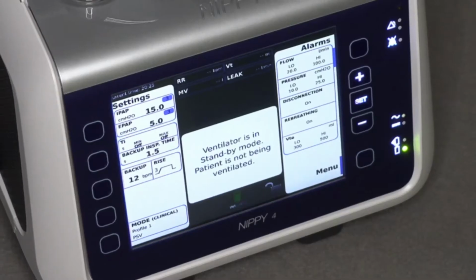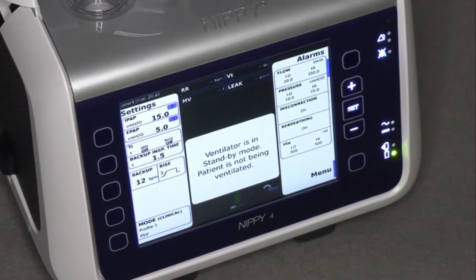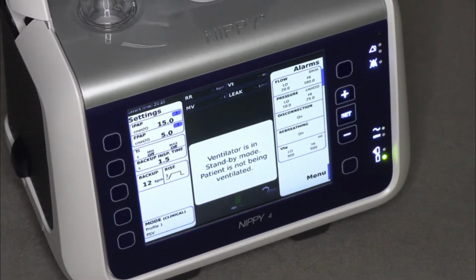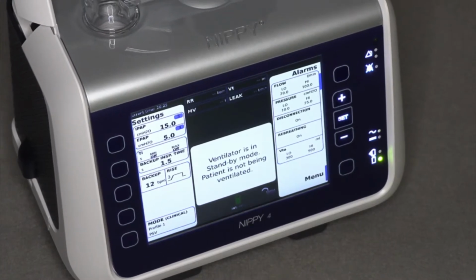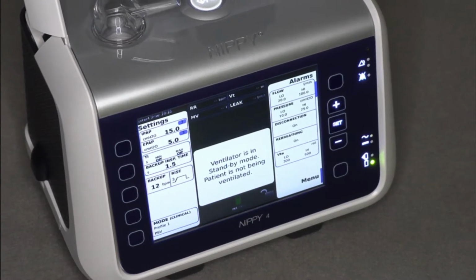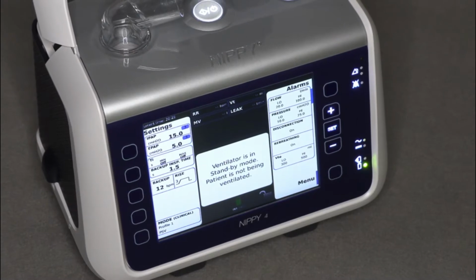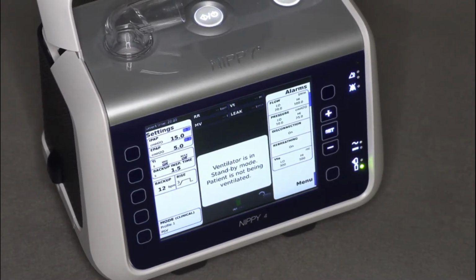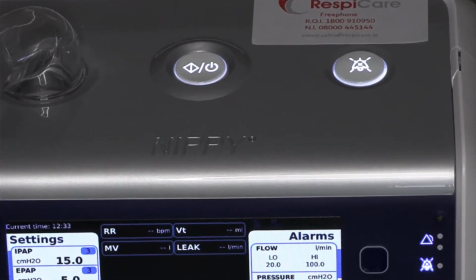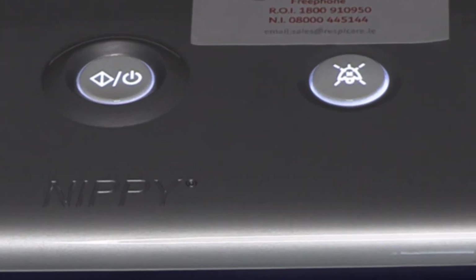On the fascia panel you'll see the large display screen surrounded by buttons with various symbols. Most of these buttons are for adjusting various prescribed settings on your Nippy 4 and are intended for the clinical staff. But you don't need to worry, all of the settings on your device will be preset and locked, so that even if you accidentally press a button that you wouldn't need to press, you won't have made any adjustments to any important setting. On the top of the therapy device, close to where the tube is connected, you'll find the power button and the alarm mute button.